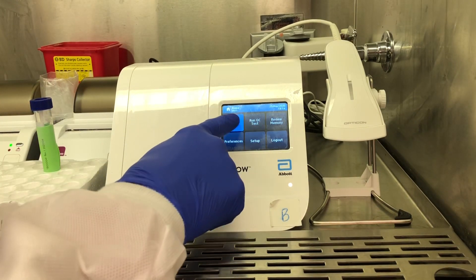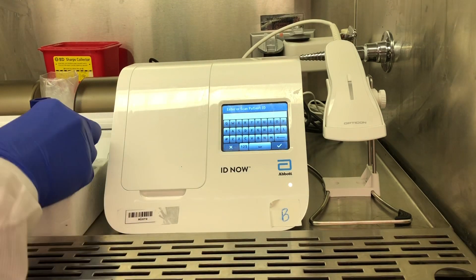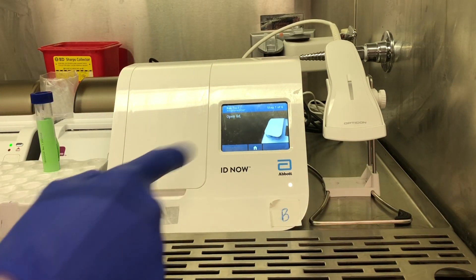On the ID Now, go ahead and hit run and select COVID-19. It's going to ask you to enter the accession number or an identifier for the patient. Once you've done that, you'll select OK.